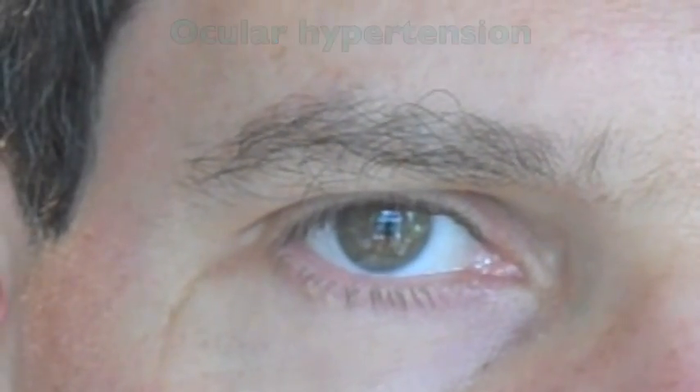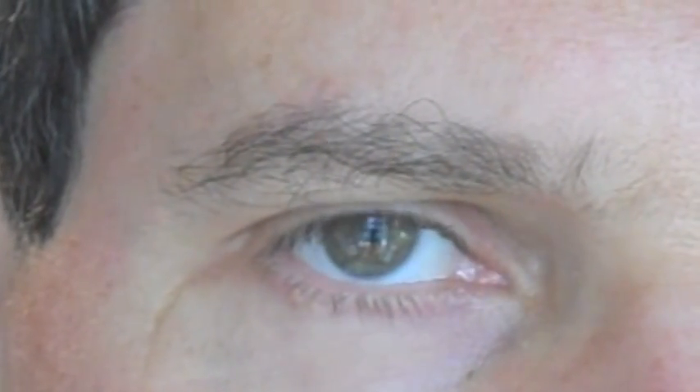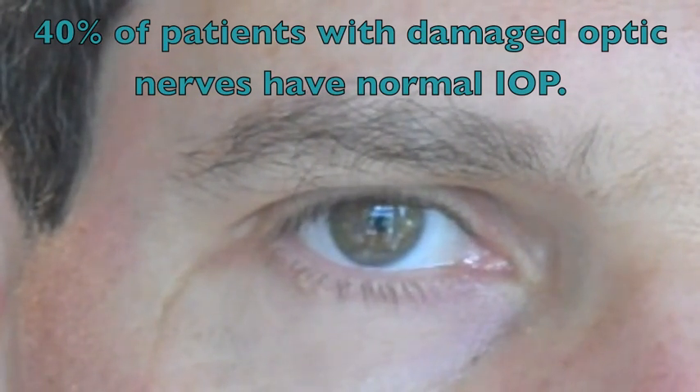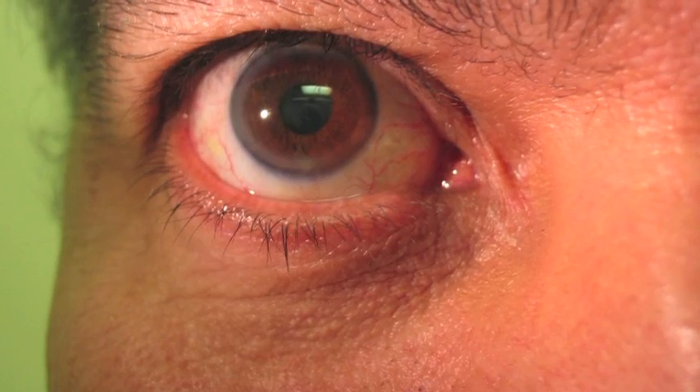That patient may be at risk for developing glaucoma over time. As the normal IOP can vary from person to person, keep in mind that about 40% of patients with damaged optic nerves due to glaucoma have normal IOP. Besides glaucoma, abnormal results obtained during tonometry may be due to eye trauma. Ocular hypertension can also be associated with corneal arcus.